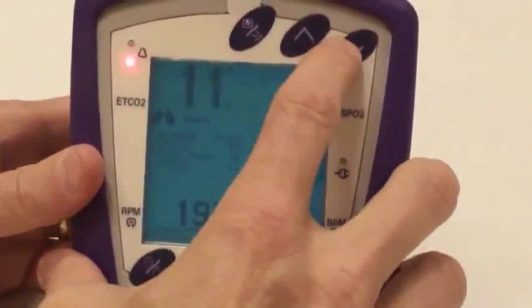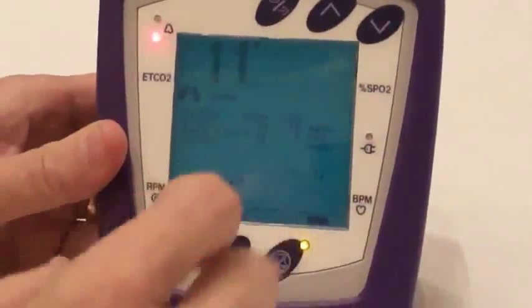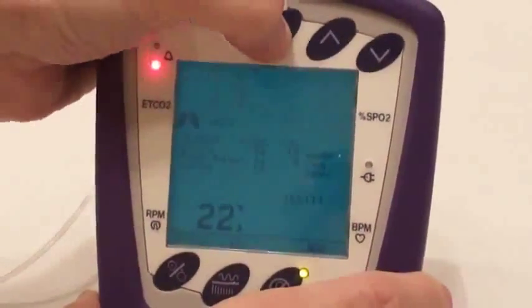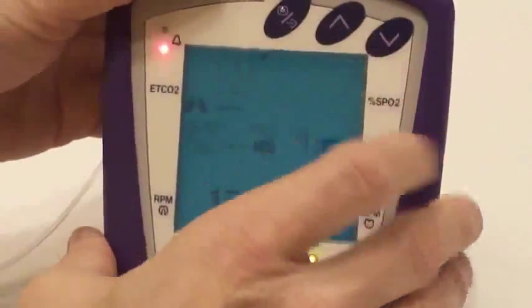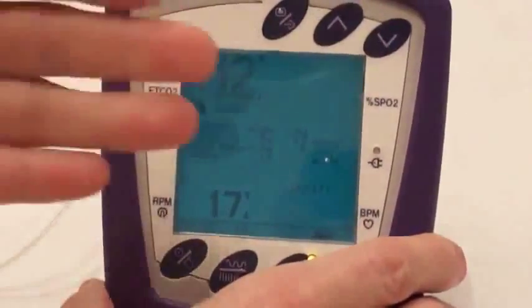If we wanted to do respirations per minute we would just go right down here to the next respiration rates per minute. Right now we've got the alarm set at 44. If we want to change that we just press the menu button. Using the arrow key up or down we can adjust it. Then once it's adjusted press the menu button again and it's locked in.